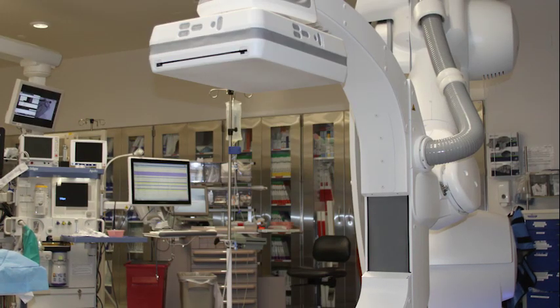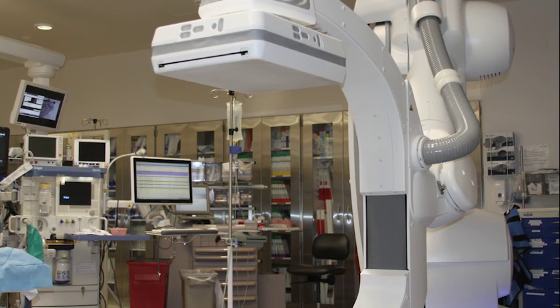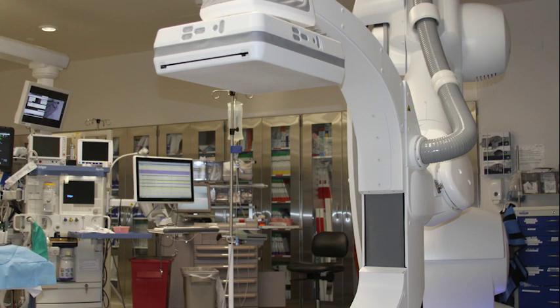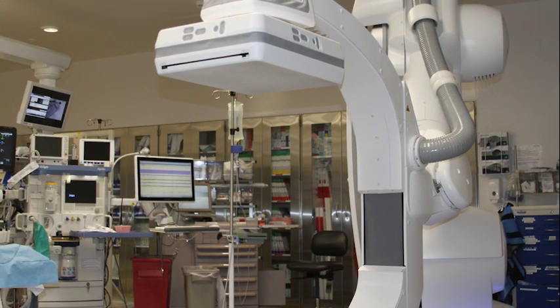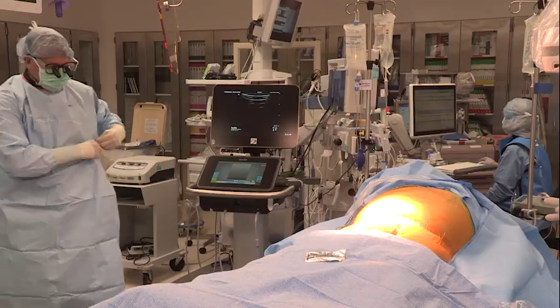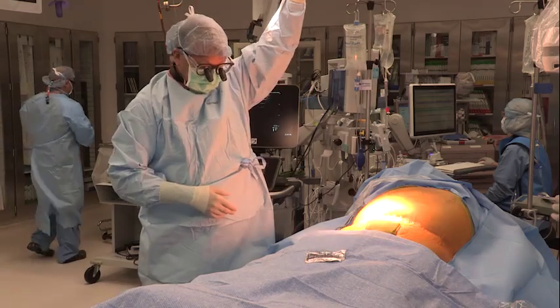Whenever possible, the IVUS tower and the C-arm should be situated on the side of the table opposite from where the physician will stand. The monitoring equipment should be placed at the top of the table near the patient's head. The patient will lie supine, and the physician will stand on the right side of the patient and the table.